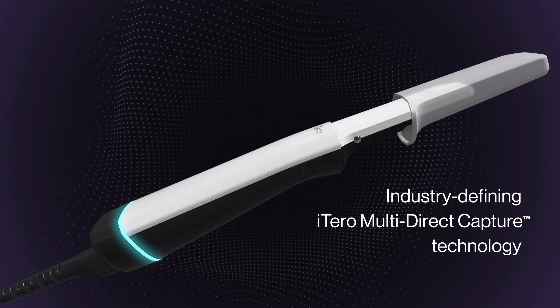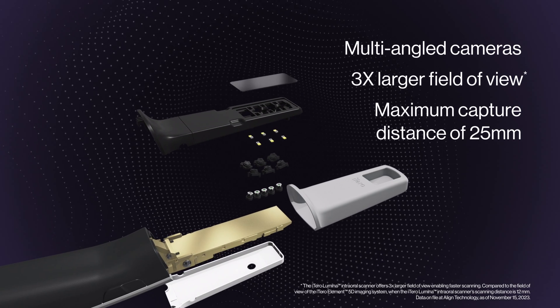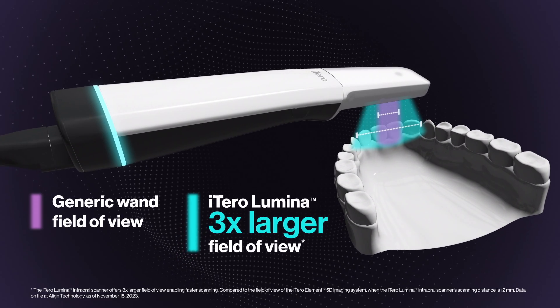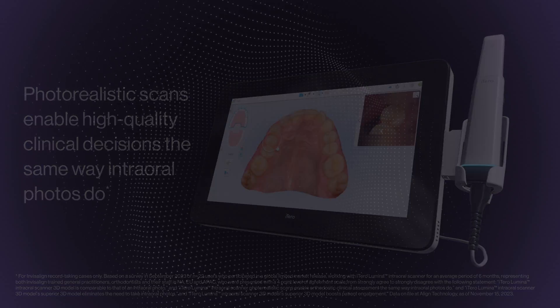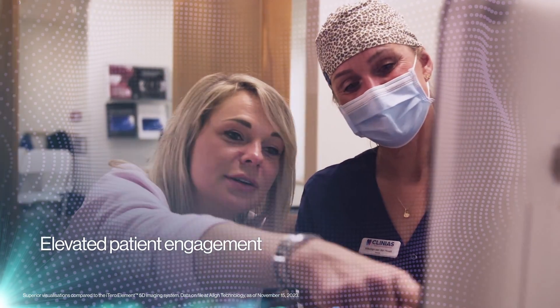Powered by our industry-defining iTero multi-direct capture technology, the iTero Lumina scanner is ushering in a new generation of digital imaging. Imagine capturing more data from more angles, with photorealistic scans that enable high-quality clinical decisions and superior visualizations for more engaged and motivated patients.